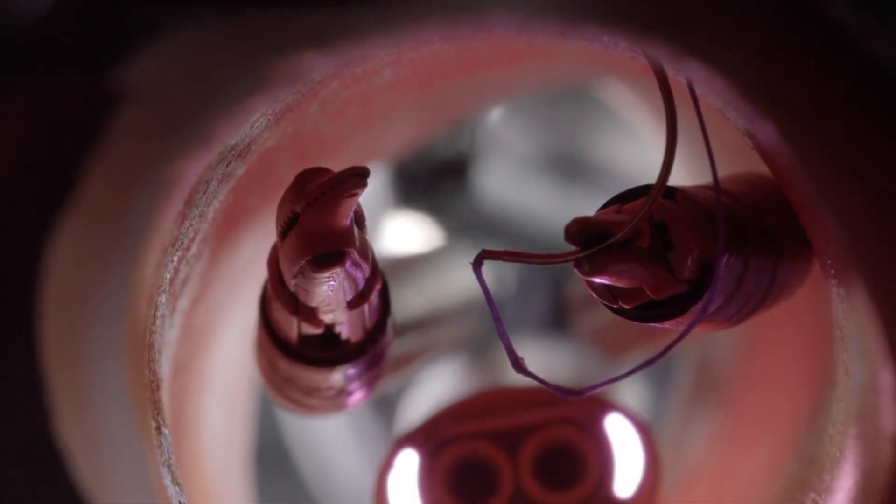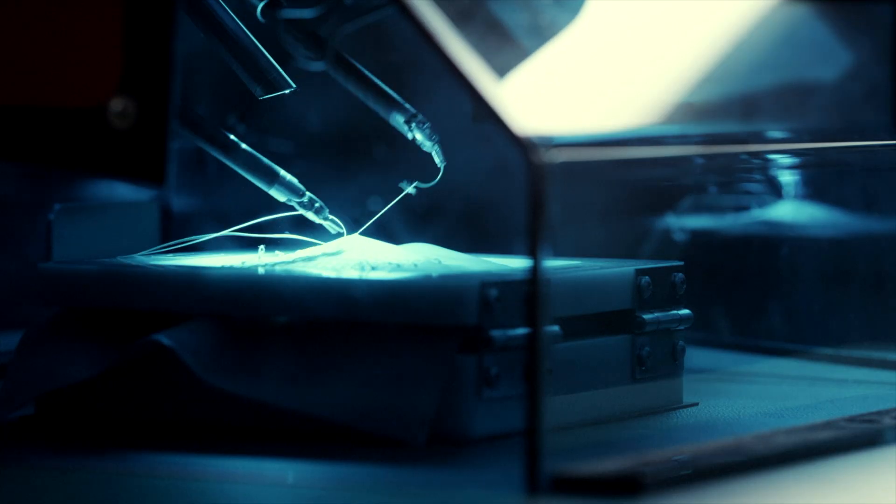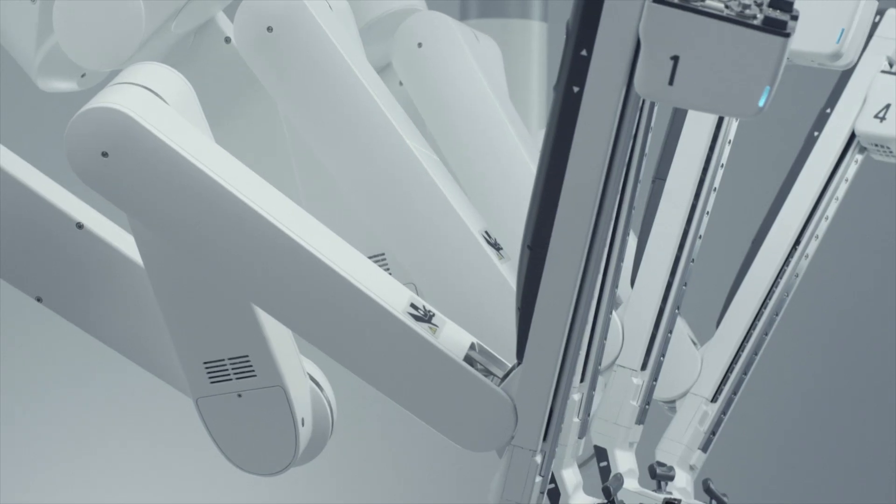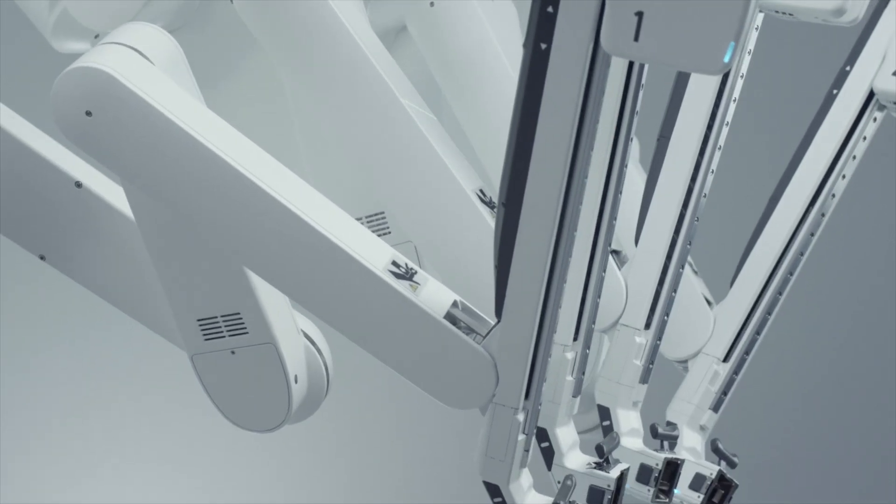We are extremely excited for this. The range of procedures that can be performed with robotics is vast. It encompasses a number of different procedures within a number of different specialties.